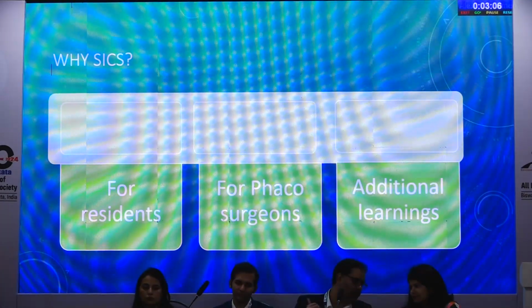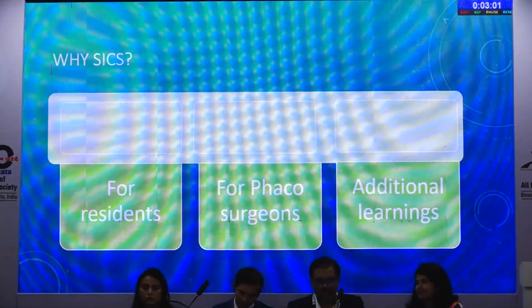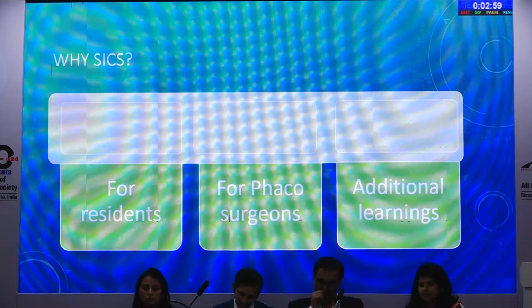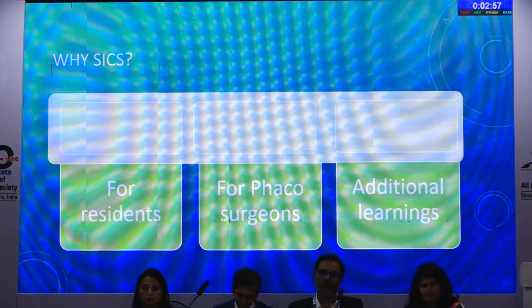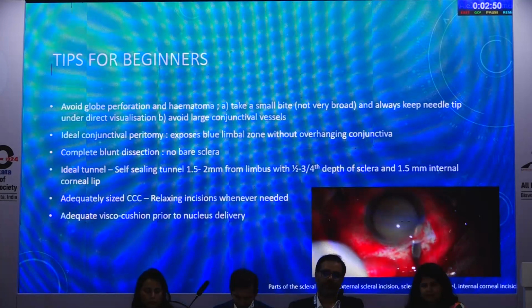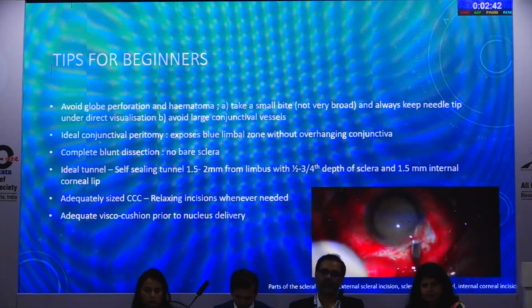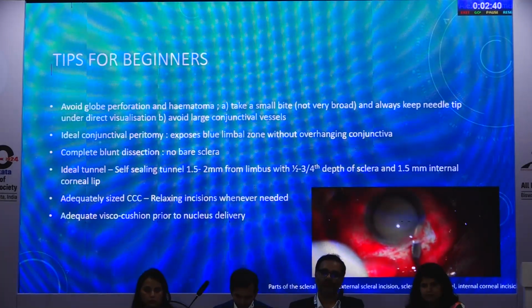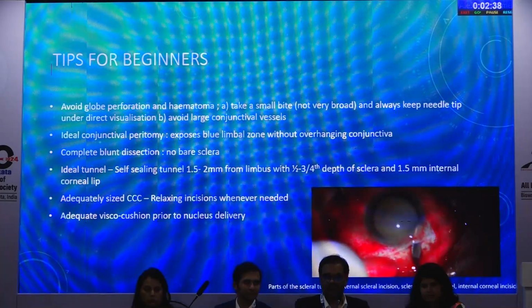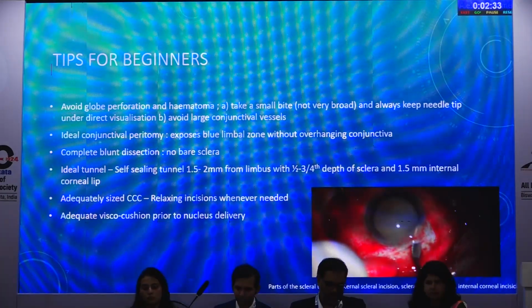I'll just cover it in three topics: why it's important for residents to learn SICS, why for practicing phaco surgeons, and certain additional learnings from SICS. SICS has a steep learning curve, and it is unlike phacoemulsification. There are multiple steps to it, and if you go wrong in any of the steps, your surgery can get complicated and you may not get the desired results. So for each and every step, you have to be very particular. For the residents, these are certain tips to master your SICS from the initial go.